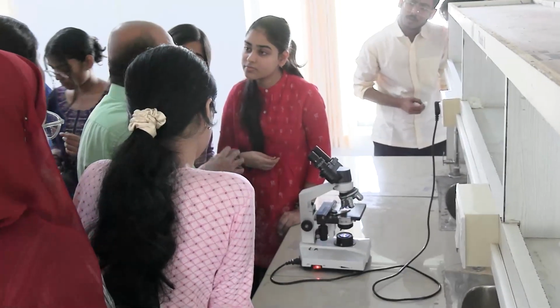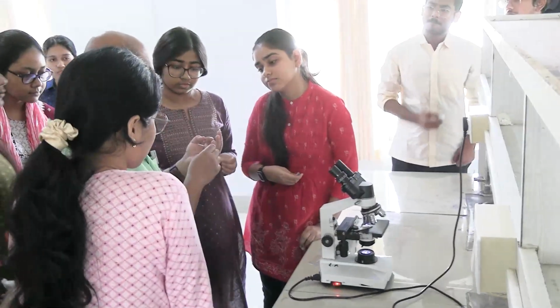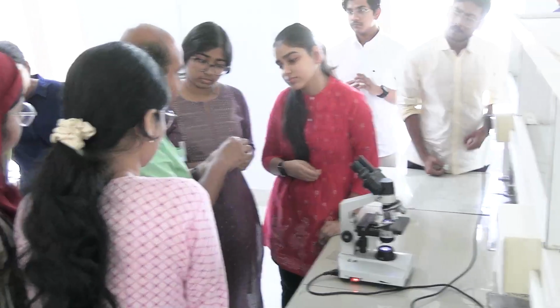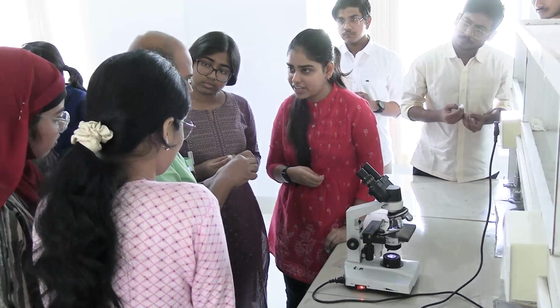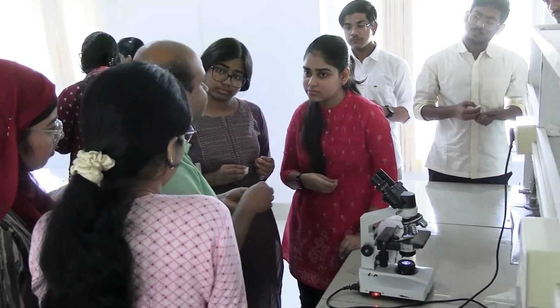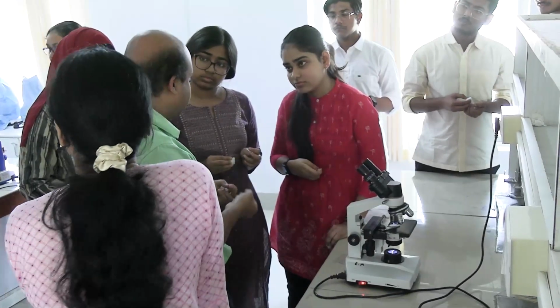Before pricking, what are the precautions to be followed? Those who had joined earlier should know by now. You have to rub the finger with spirit and cotton and dry it. Why dry the spirit? Otherwise, when you prick, the blood may get mixed with the spirit.